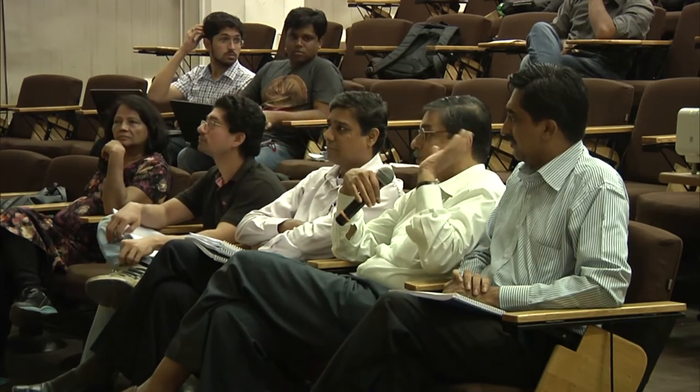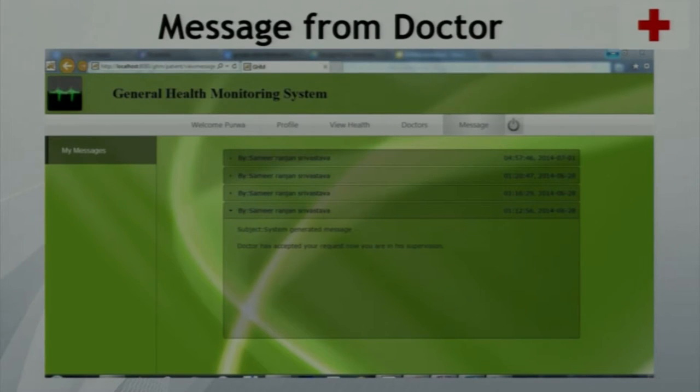A question was raised about why separate software was written for patient and doctor, rather than treating a patient as a doctor with a single patient. The team explained that there are different features for doctor and patient, so different modules were used. The mentor pointed out that the core data-viewing functionality is similar — the doctor has a full list while the patient has only one — and questioned the reusability of the code. The team acknowledged the point. When the patient clicks on the message tab, all messages from the doctor appear, including system-generated messages such as doctor has accepted your request or doctor has removed you.